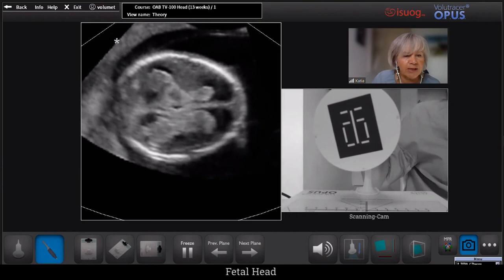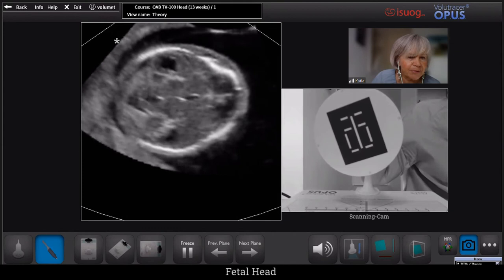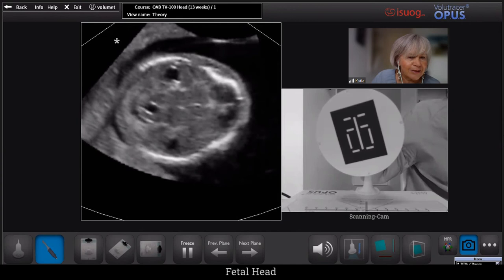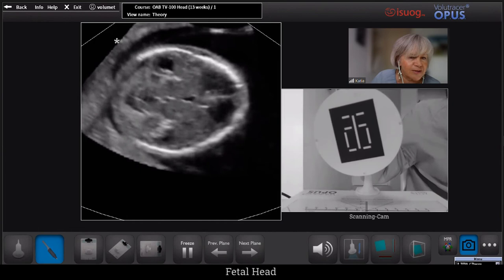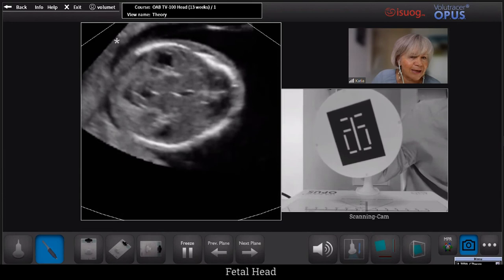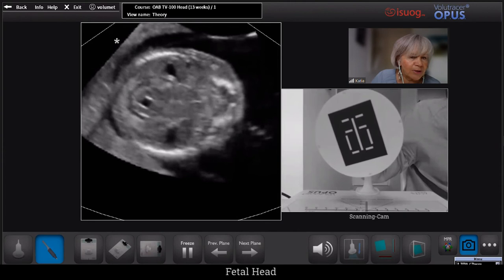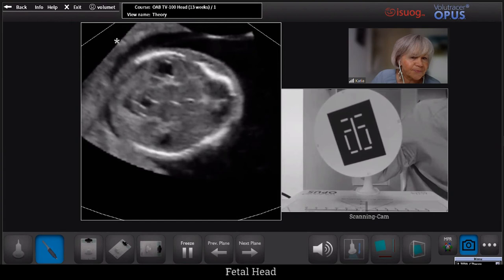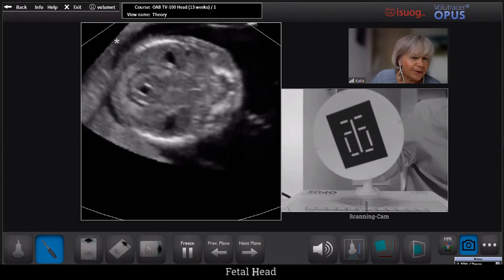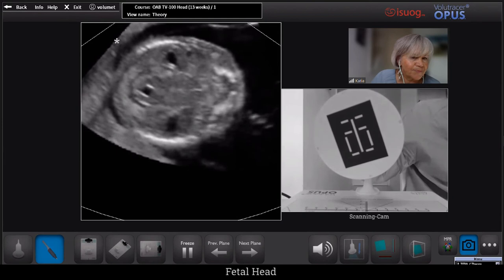We want to get more information about the fetal anatomy, so let's navigate through this volume with very gentle movements to reach deeper structures in the brain. We can see here the thalami, and we can also see the cerebral pedunculi, which are behind the thalami going towards the back of the head. The black structure in between the two pedunculi is the aqueduct — that black structure defined by white lines.